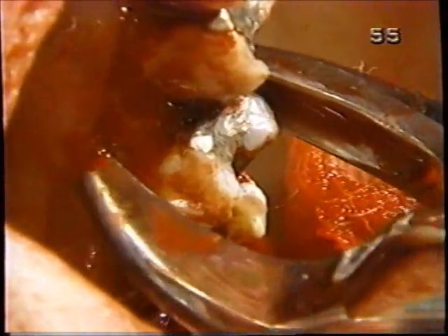This one probably won't be as conical. It usually isn't. Okay. Let's leave that one for a minute and go to the bi.